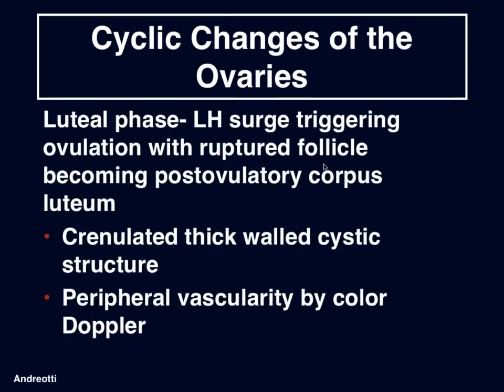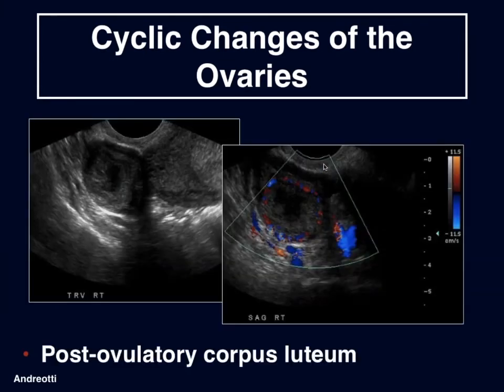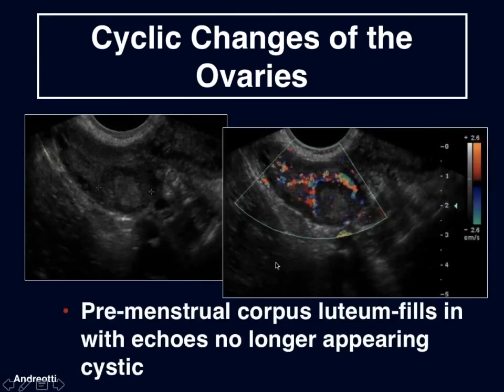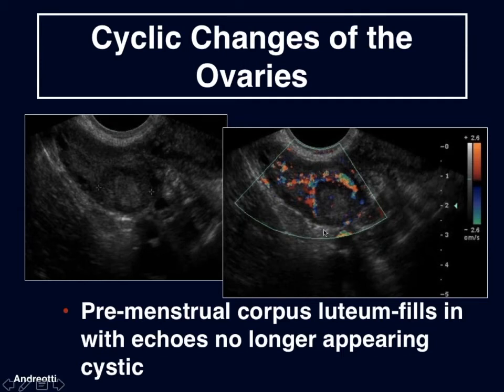Here we have the ovulatory follicle, which usually measures between 18 and 25 millimeters. Within this ovulatory follicle, often around 24 hours prior to ovulation, we may see a smaller cystic structure called a cumulus oophorus — a structure formed by the separation of the granulosa layer of the follicular wall from the thecal layer containing the ovum. Following the LH surge which triggers ovulation, a follicle will rupture and becomes the post-ovulatory corpus luteum — a crenulated thick-walled cystic structure that also demonstrates peripheral vascularity by color Doppler. The pre-menstrual corpus luteum will then form and fill in with echogenic material, predominantly blood, and no longer appears cystic.